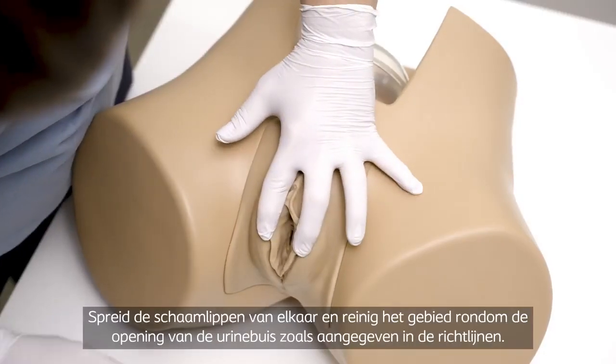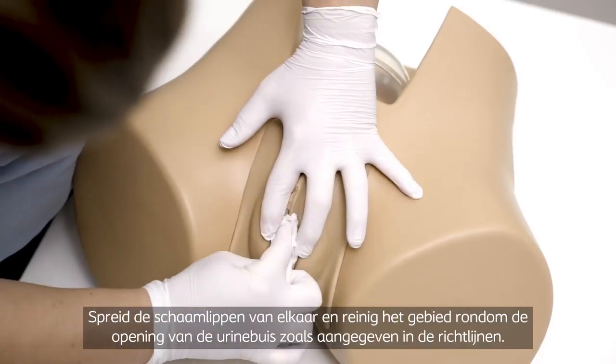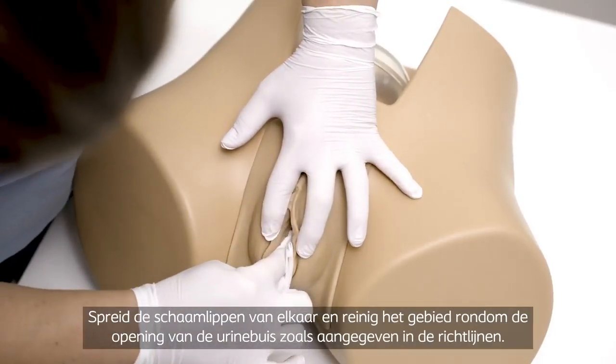Spread the labia apart and clean the area around the urethral opening according to guidelines.